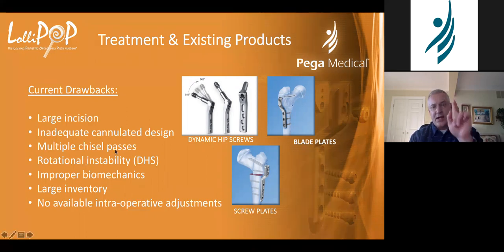And so you put your guide wire in, and with a fixed angle device, you have to calculate your angles, subtend angles off of different wires, and it's all doable. If you do a lot of proximal femoral osteotomies, you can use a fixed angle device, and that's great, but can you make it better? And that's the idea that we ran with.